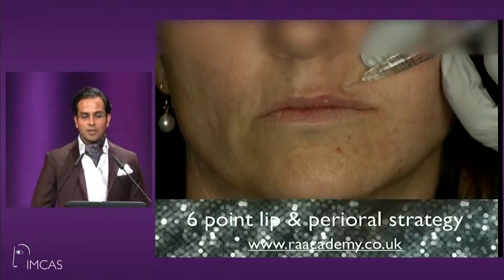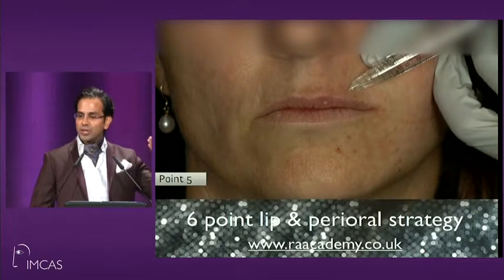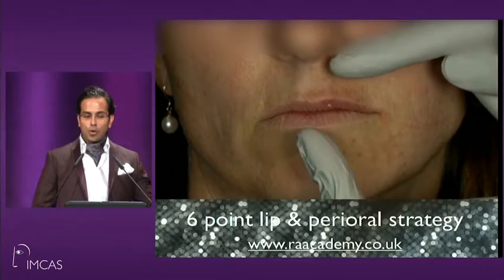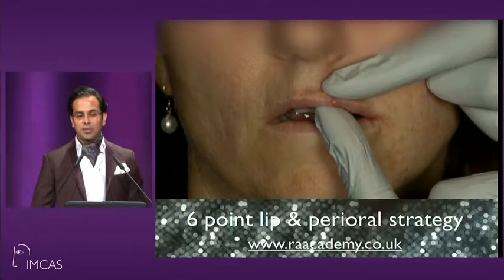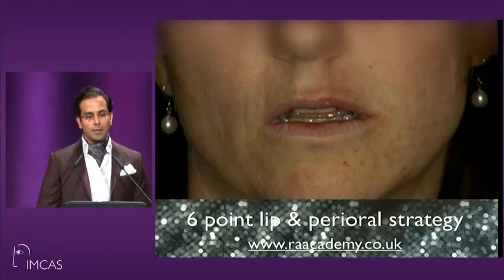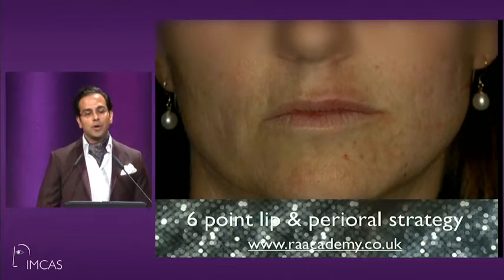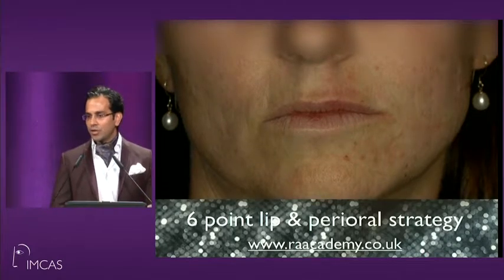and this is subcutaneous, and then I'm just going to wash HA in behind the mucosa where I've left a little bleb there. More medially, less laterally, and then a very slight little mold just to make it comply with the tissue. And we now have volumetric balance. If you wanted to augment the lower lip further, you can do the same approach on the lower lip.